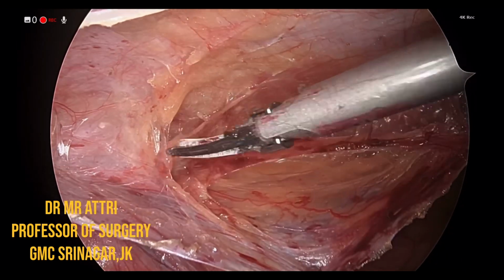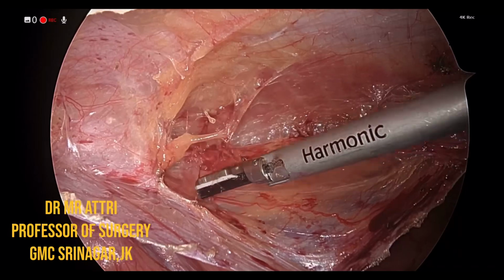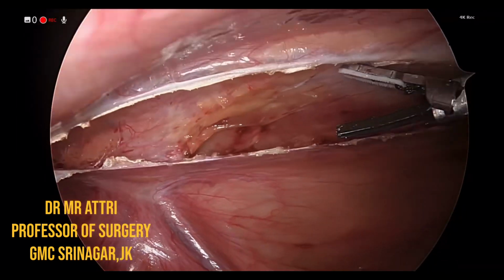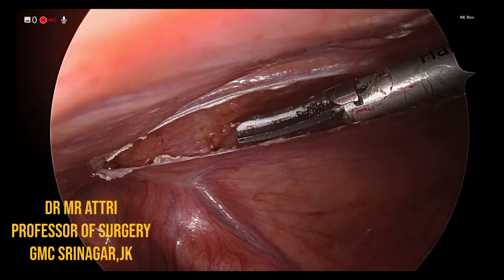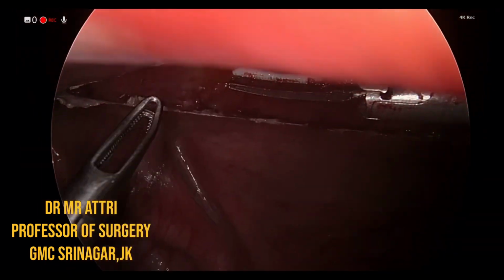This is the most crucial step in hernia surgery, because if you deviate from the path that you have to follow, like you can see there is this cobweb appearance, that is the surgeon's friend. I keep on repeating, with this cobweb you are in a good plane. You will have minimal bleeding, but if you deviate from it, you're bound to have a lot of bleeding during the procedure.